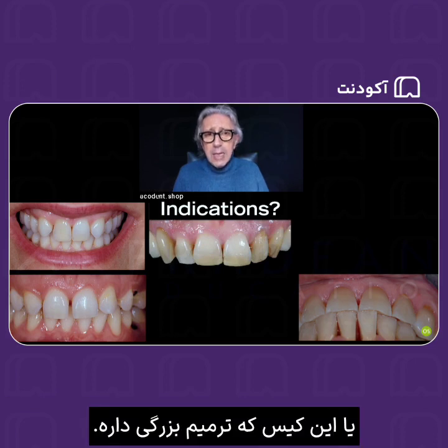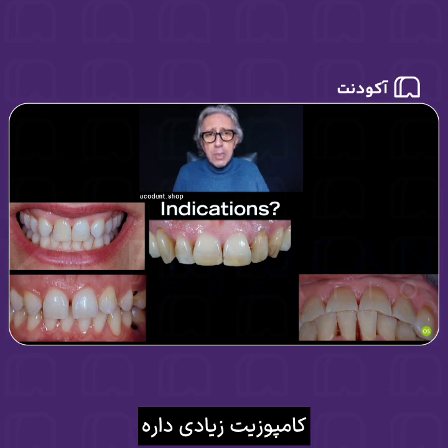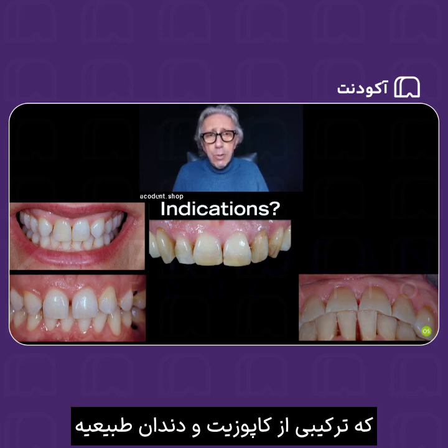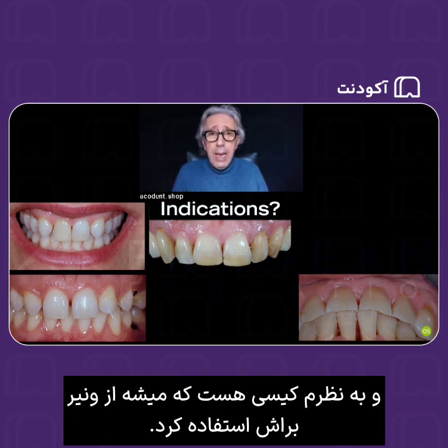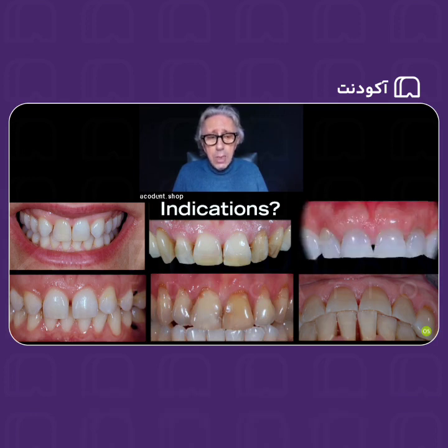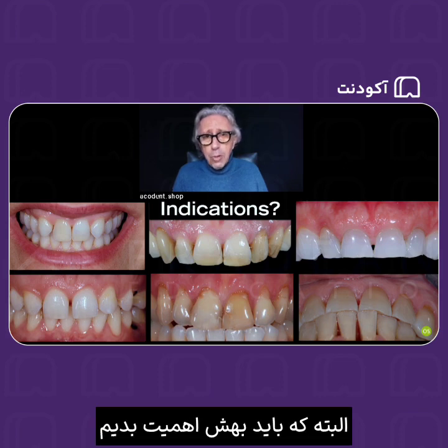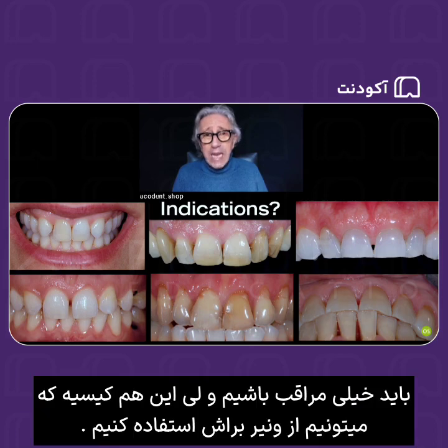Or this case, having big restorations and a lot of composites, a combination between composites and natural dentition, and I believe that is another case that can be used. Colors can be changed, or even incisal wear. Of course, we have to take really great care about it. We have to be very careful, but that's another case in which veneers can be used.